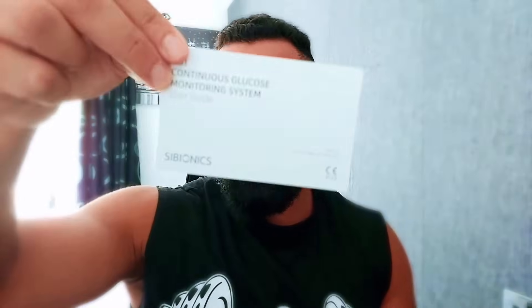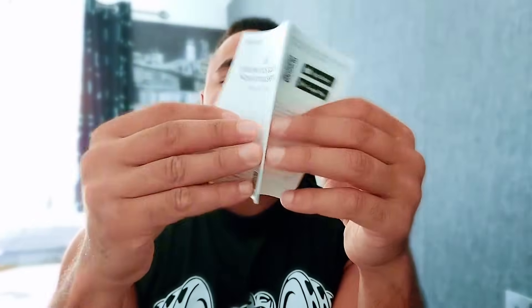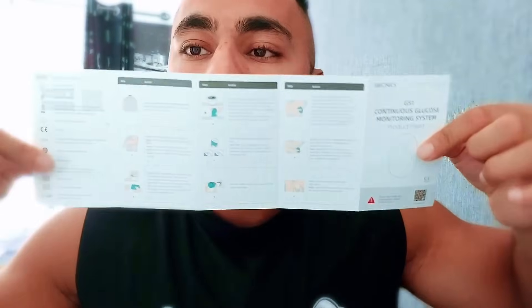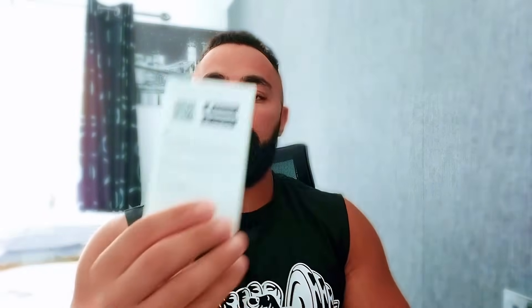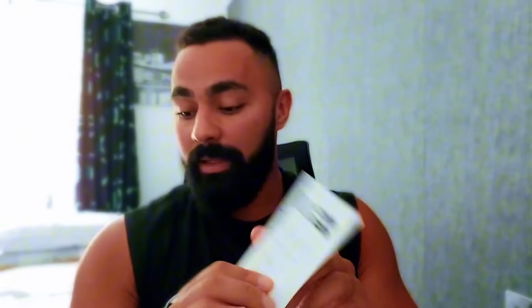So for installing the product, I've got to show you this — it's a user guide, good to read. This is a step-by-step guide to install the product, telling you exactly what you need to do and how. First thing, you would probably need to download the app — just scan it and download. I've already downloaded it, and then you need to follow from step one to nine.